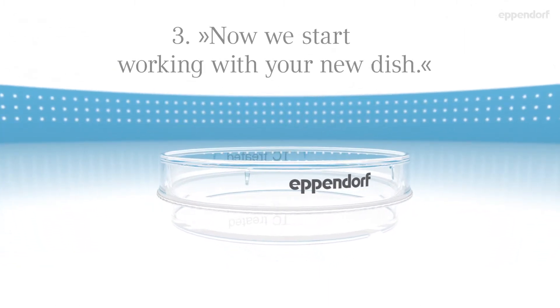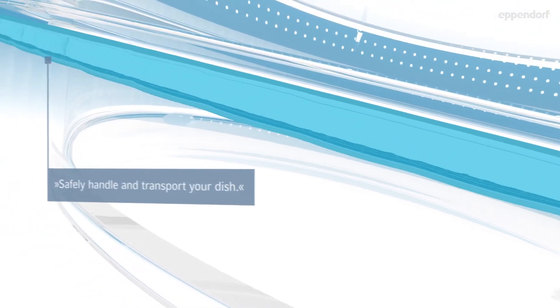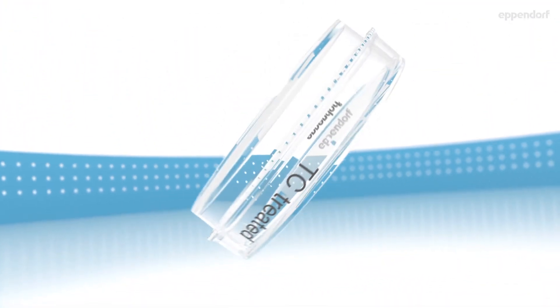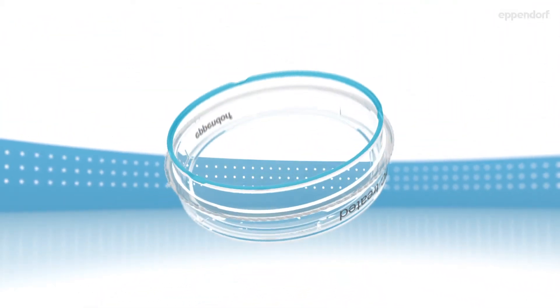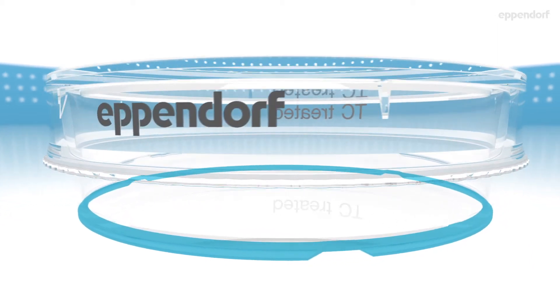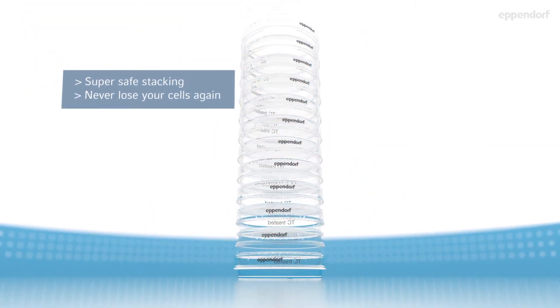Now we start working with your new dish. That's your corrugated handling ring — just hold it and feel the difference. Safely handle and transport your dish. This is your stacking ring — super safe stacking. Never lose your cells again.